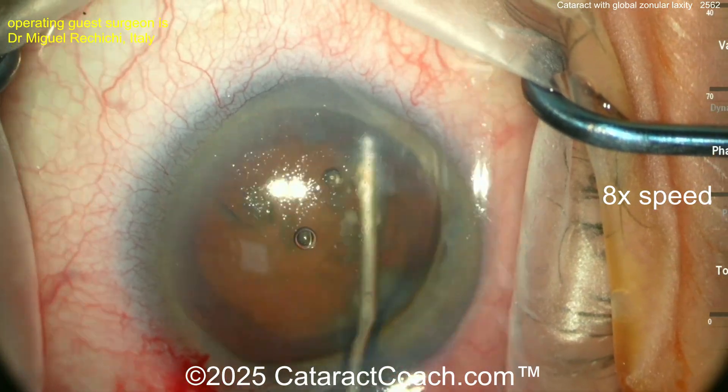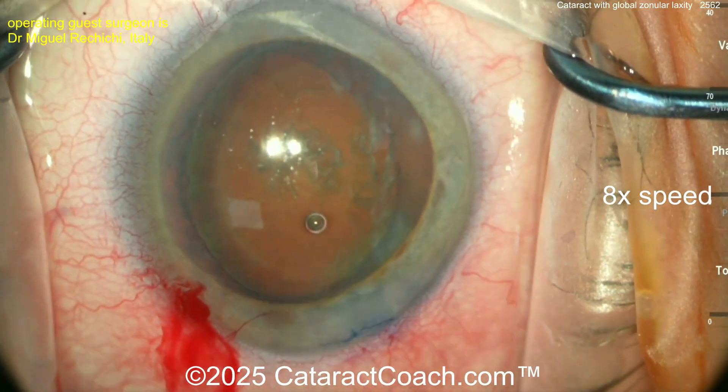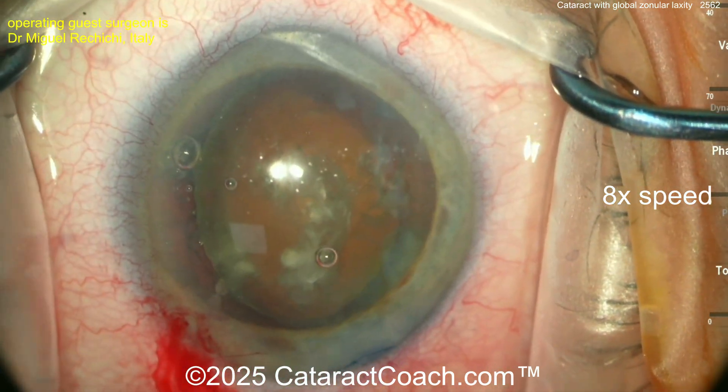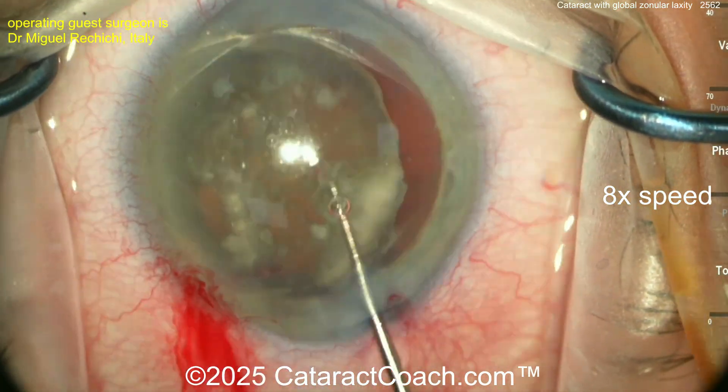He was on our podcast yesterday, so check it out if you're not already following the CataractCoach podcast. He just did a hydrodissection and got the nucleus out of the bag. This technique of bringing it out of the bag may produce less stress on the existing zonular support.